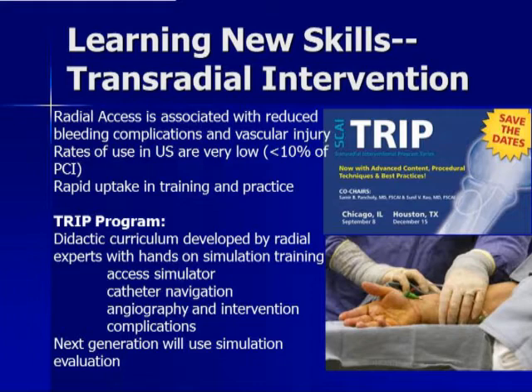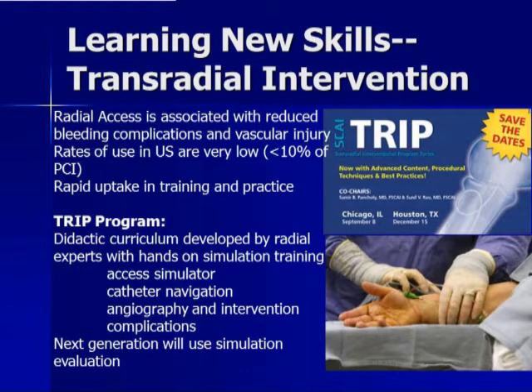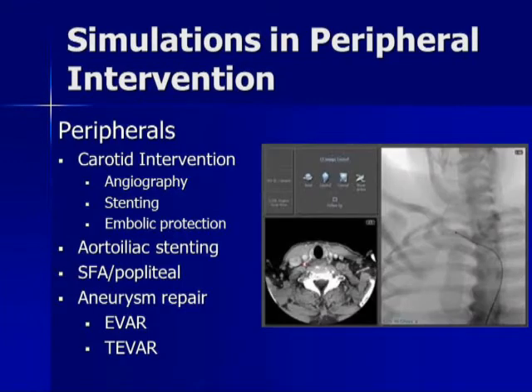So this has really been a very exciting field for us, because this diagnostic approach to angiography, which is a very common procedure, is now a route by which many people can be exposed to simulation training who are actually in practice, not just training programs. And this is one where many of the fellows, my 2 fellows that are finishing this year, have each done over 500 procedures. They're going to go out and actually teach the faculty at the programs that they're going to. They're actually better than most people doing it, so it's been great. But the simulation component of this is a huge, huge advantage, being wrapped around the didactic component and having hands-on training.